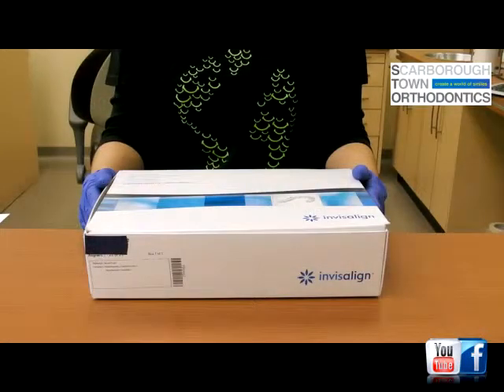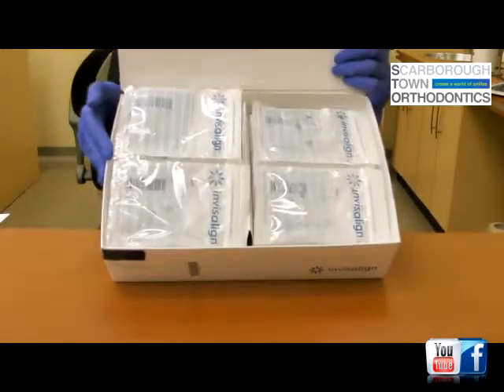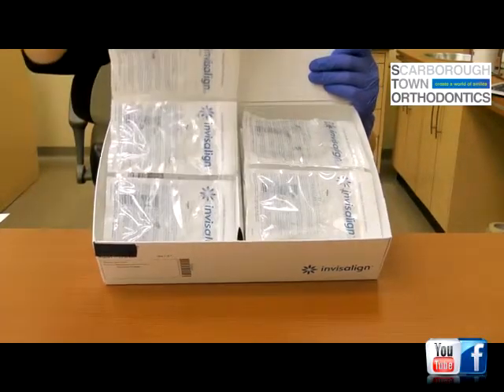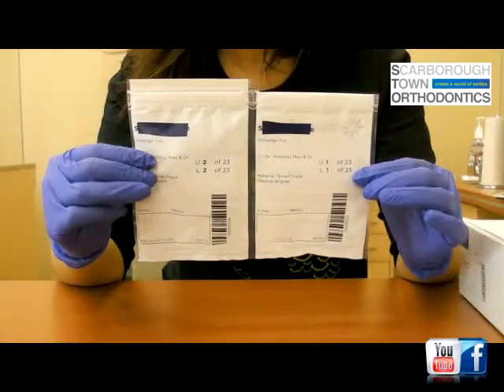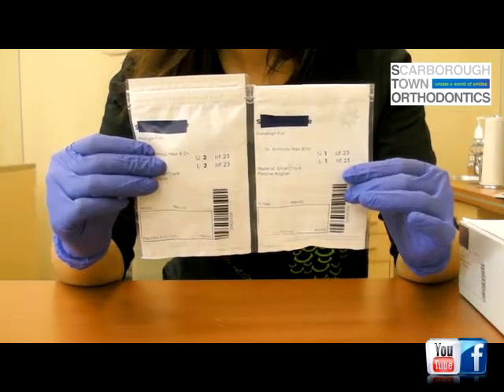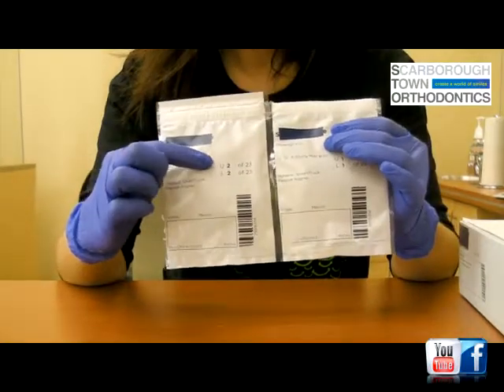Your aligners are sent to us from Invisalign in this box, and inside you will find the complete set of all of your aligners. However, you will only be receiving number 1 and 2 today, and the doctor will indicate how long you need to be wearing each one. Inside each package you will find an upper and a lower aligner, and the package clearly indicates which is number 1 and which is number 2.